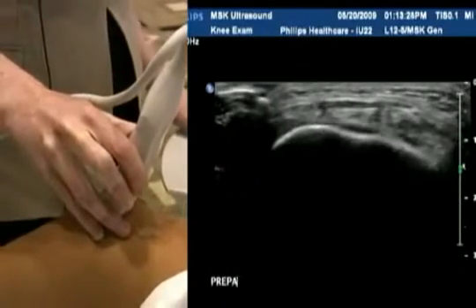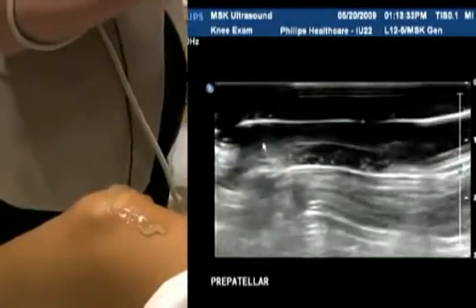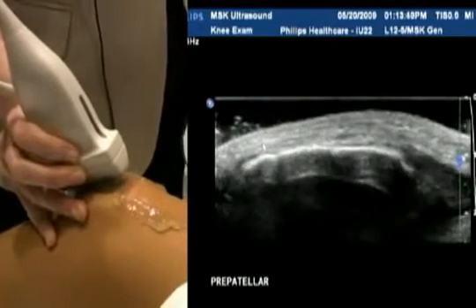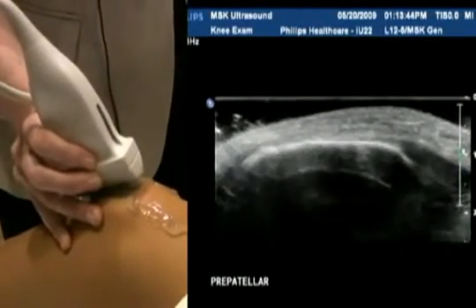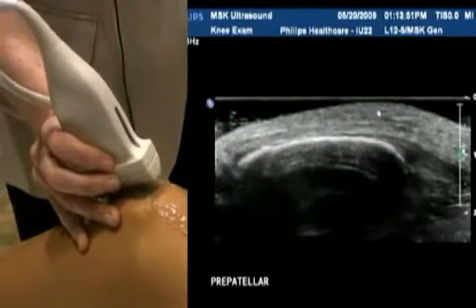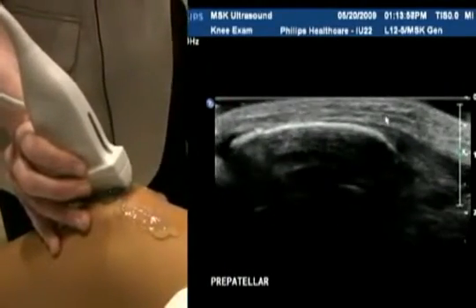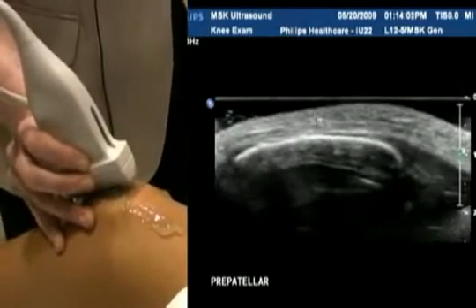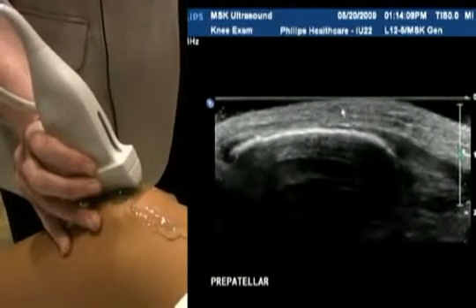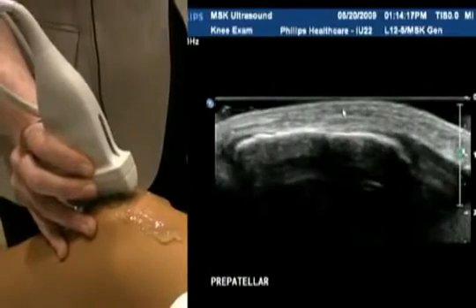We're going now to the pre-patellar area of the knee. There is a bursa that lives in this spot. Patients will invariably present with inflammation or a bump on top of their knee. You need to use a fair amount of gel for the pre-patellar portion — you can see I've got a little bit of a standoff created by the thick gel, because the pre-patellar bursa sits in the subcutaneous region above the patella tendon. If you push too hard, you can completely compress it. Just imagine if there was a line of fluid sitting above the patella tendon, above the mid portion of the patella — that's where you're going to find the bursa. It is indistinguishable unless you have fluid in there, so make sure that you're not pressing too hard and obliterating the bursa completely.